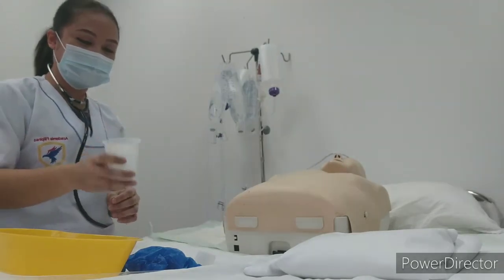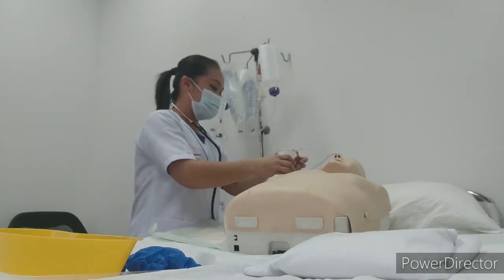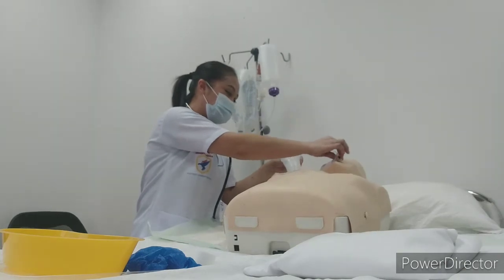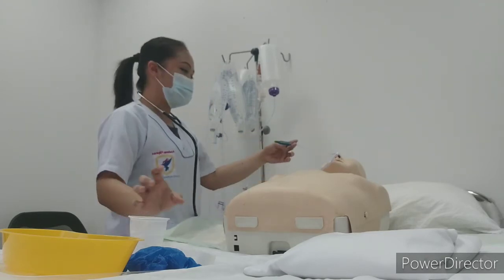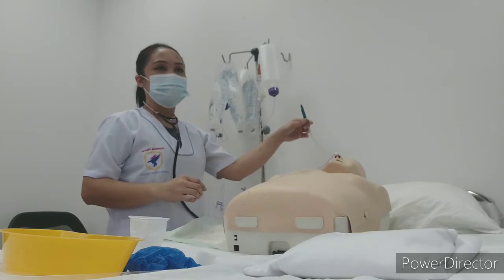The third test, a cup of water. So we will soak this one, and if you see there are bubbles in it, it means it's not okay. So we need to do again the procedure from number 1. Okay? So assuming it's already okay, now we will start the feeding.